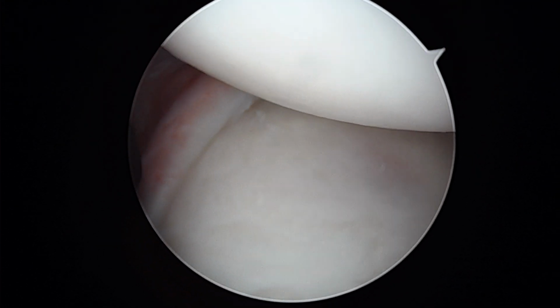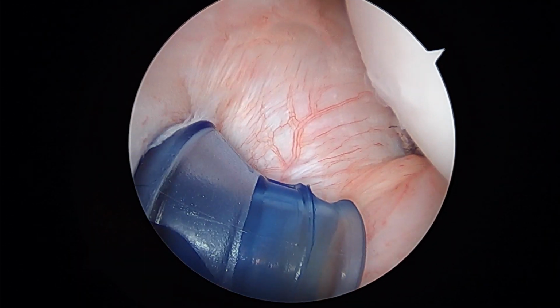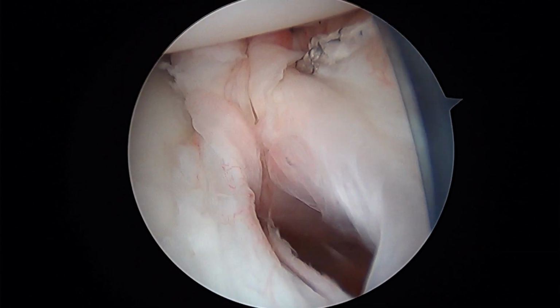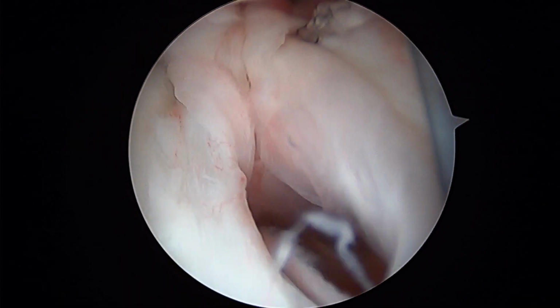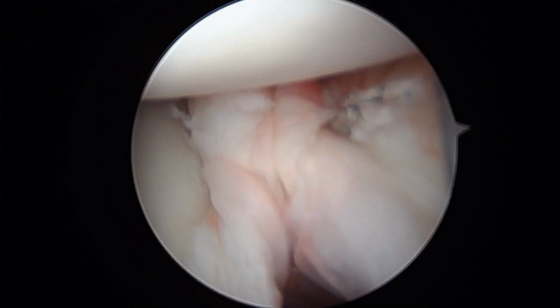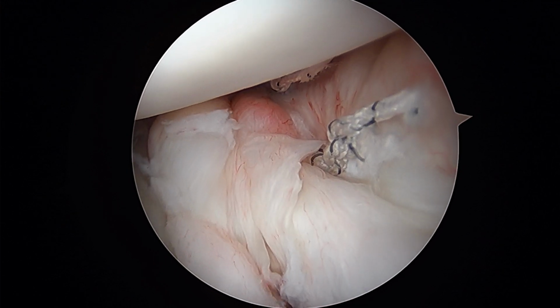So you can rewind the tape and see where we started with your shoulder. Now we have that posterior mattress. We have 2 anterior mattresses. Remember all that space that was here? Now there's just a little bit of a recess there that's actually part of normal anatomy most of the time. And down the front of the shoulder, it gets hard to even see. So I'm really happy with the way that looks.